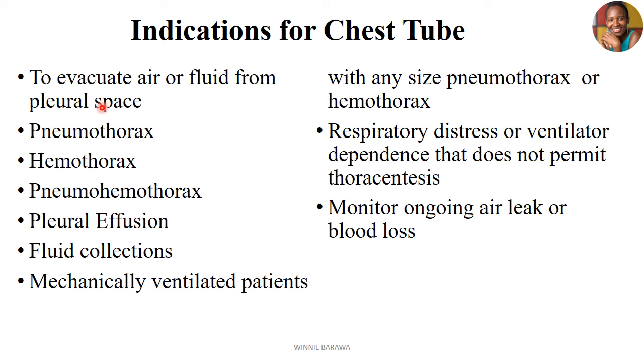So the main indication is basically because you want to evacuate air or fluid from the pleural space, and in these cases you could be talking about diseases like pneumothorax, hemothorax, pneumohemothorax, pleural effusion cases, but also pleural collections for the purpose of culture sensitivity or for pleural fluid analysis. In pleural fluid analysis, you could be collecting samples for lab examinations, or doing thoracentesis for the purpose of elimination.